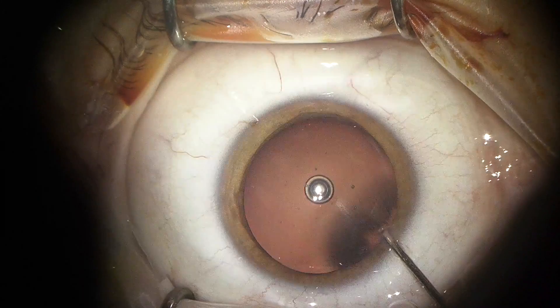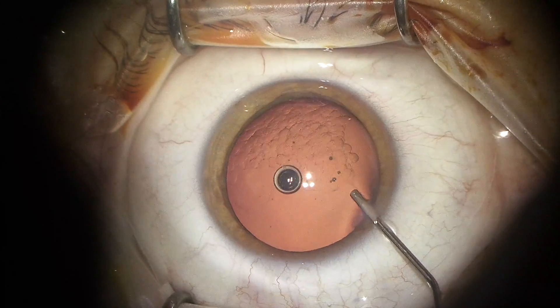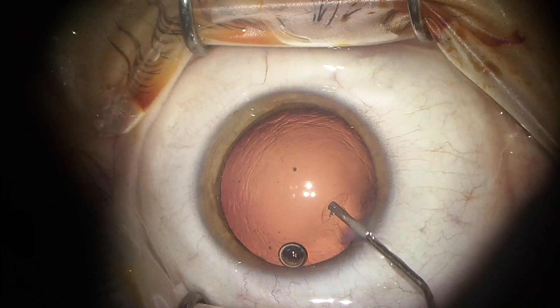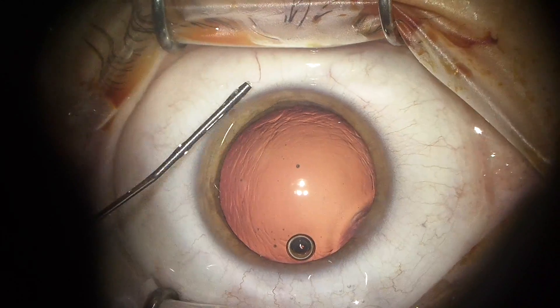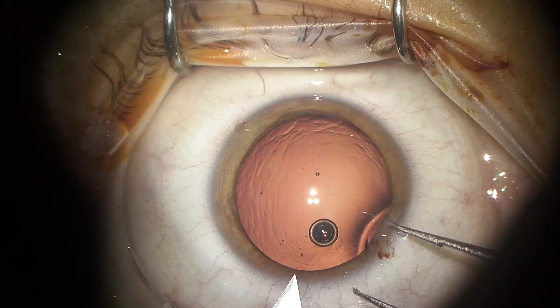As you can see, I've begun the procedure by placing two incisions at the top and the bottom of the cornea, followed by lidocaine which numbs the inside of the eye, and then we'll place a jelly-like substance inside the anterior chamber to maintain the eye's shape while we do the surgery.